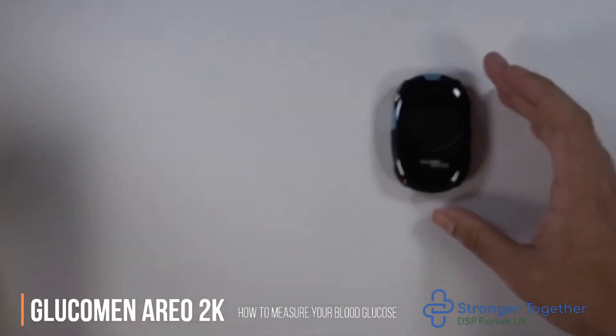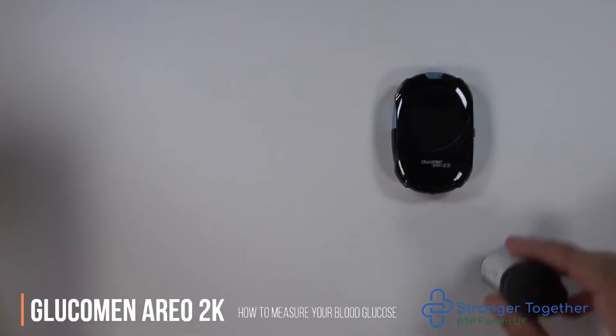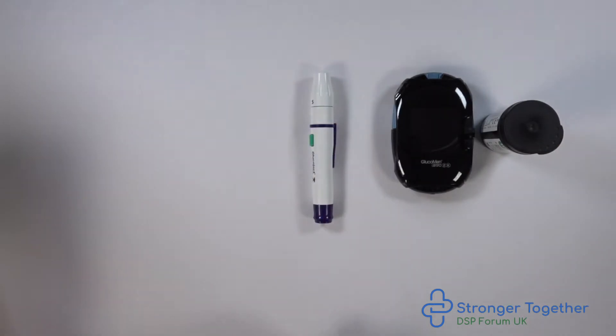You have been directed to this video because you have a Glucomen REO2K blood glucose monitoring meter. We will demonstrate how to measure your blood glucose here. This meter also measures ketones and we will demonstrate this in a separate video.